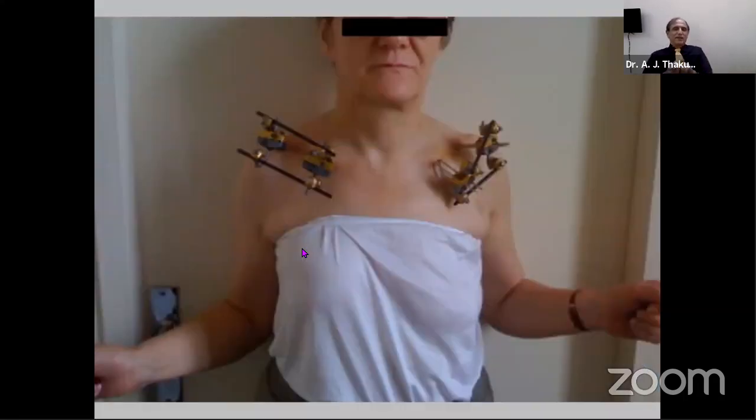This is the ultimate piece that I picked up. This lady had bilateral clavicle fractures, and this has been treated in external fixator. This is not my case. I don't even know, I picked it up from the net. This amused me, and this could be done, and done successfully. However, I find this is very cruel to the patient to keep it like this for 3 to 6 weeks. It's not very nice.